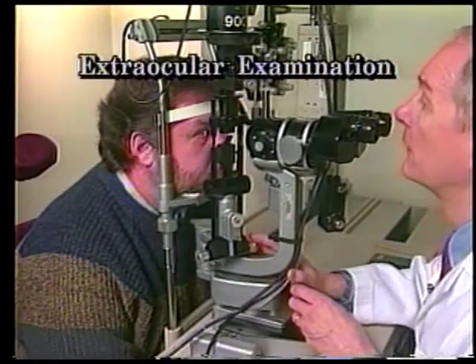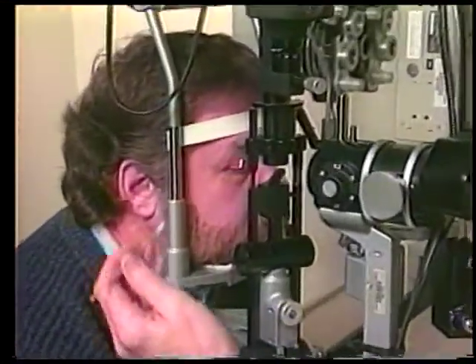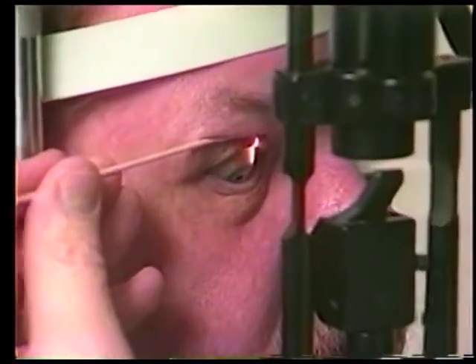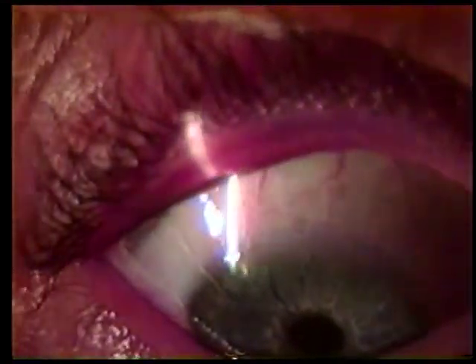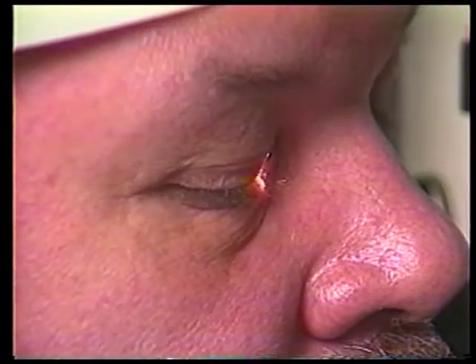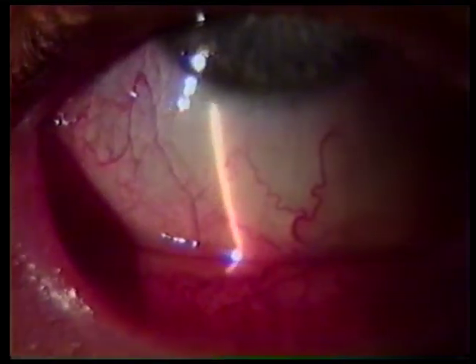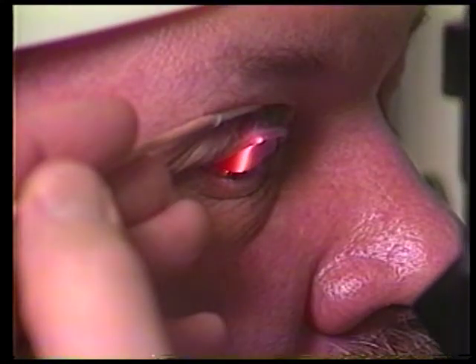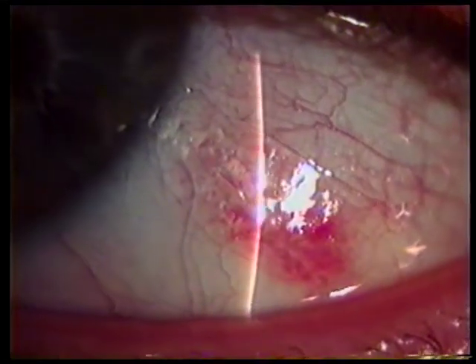Develop a systematic examination method so important areas of the external eye and anterior segment are not overlooked. Learn to use both hands for ease and comfort in manipulations around the eye. Start by examining the extraocular structures. Look at the lids and lashes. Have the patient look up and then down while you hold the eyelids with a Q-tip so that the bulbar conjunctiva normally covered by the lids can be adequately inspected. Learn to evert the upper and lower lids for access to the tarsal conjunctiva. Next, direct the light to the interpalpebral bulbar conjunctiva to evaluate this area.